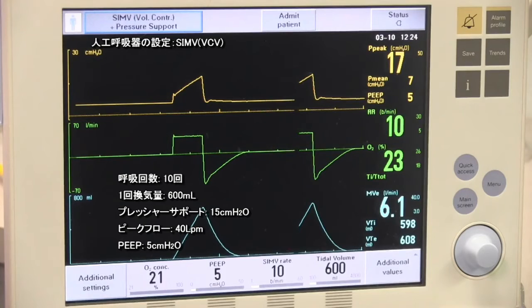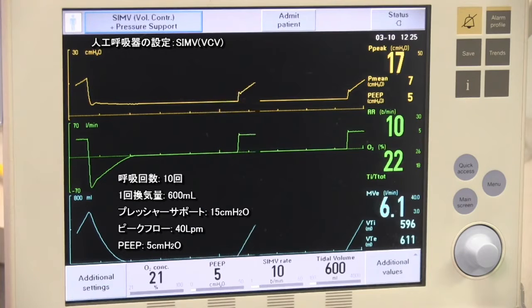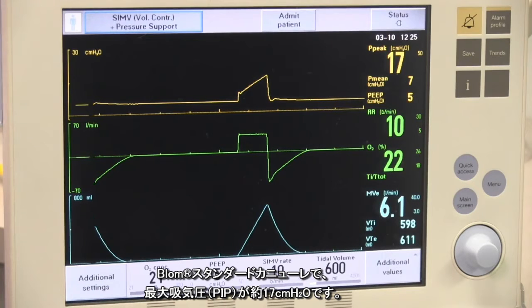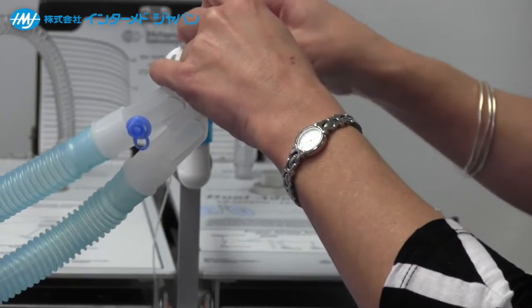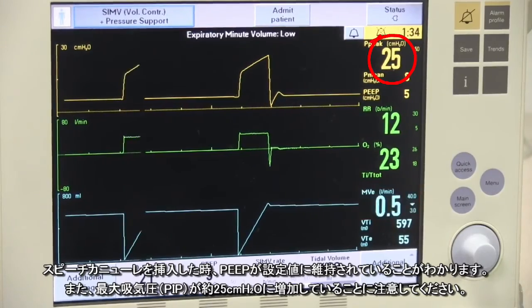To begin, we have the ventilator in volume control SIMV with a rate of 10, tidal volume 600, pressure support of 15, peak flow of 40, and PEEP of 5. With the Blom standard cannula, the peak inspiratory pressure is 17 centimeters of water. Now, with the speech cannula inserted, you can see that PEEP is maintained.